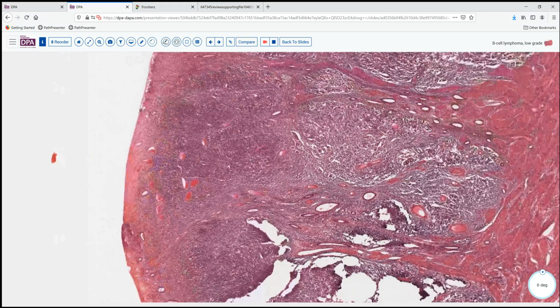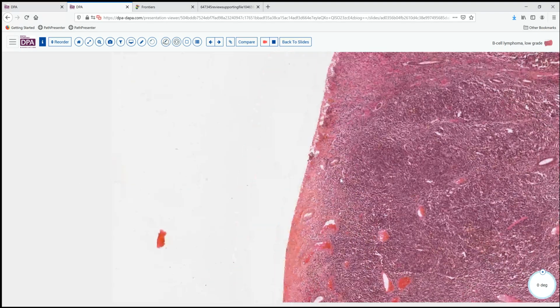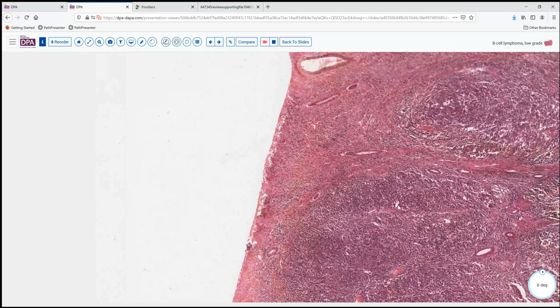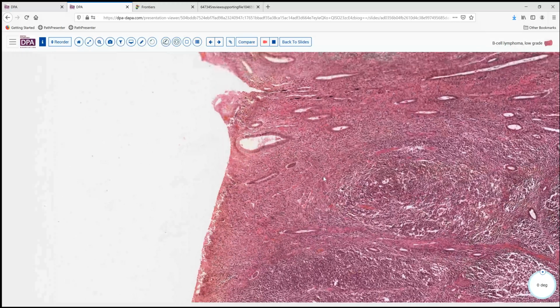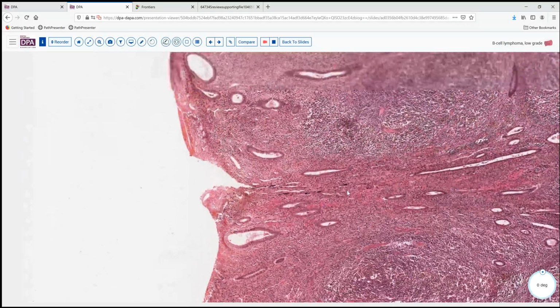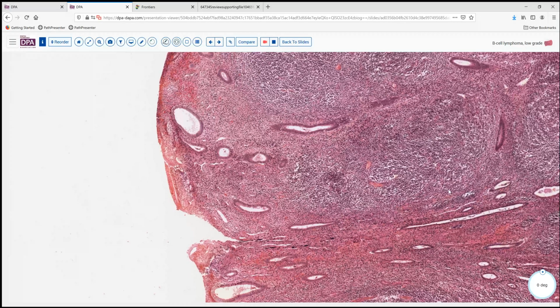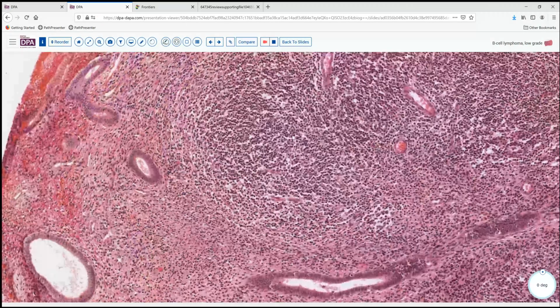And looking more closely here, we see that she has some intact, widely spaced endometrial glands here, and then this very blue infiltrate that actually seems to be sparing the endometrial glands and most of the endometrial stroma. So this is a fairly good appearance. Also, we note that there is some sense of a little clustering around the vasculature. Here we see some of these vessels here associated with this.